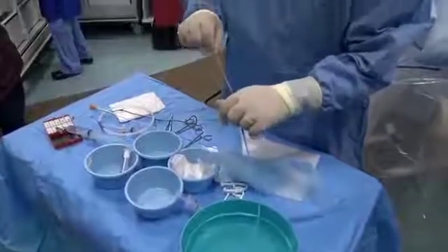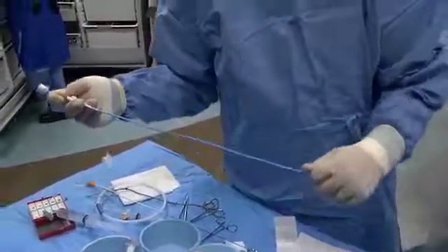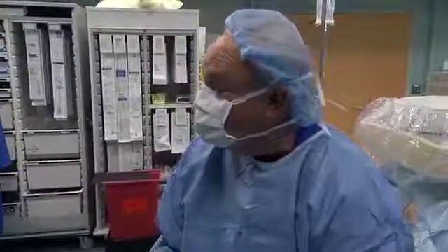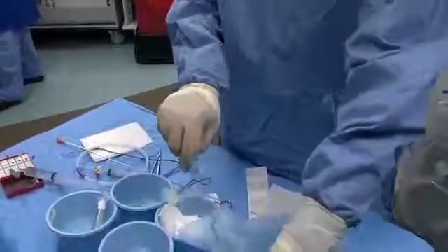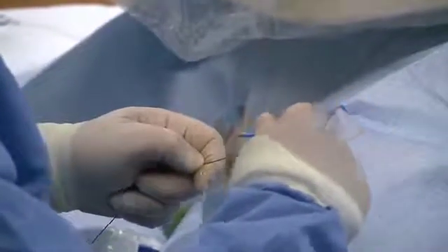Since we are doing a biliary catheter exchange, I prefer to use the Flexible Stiffening Cannula. For initial biliary catheter insertions, I start with the metallic stiffener until I get to the bend in the biliary duct, then exchange the metal stiffener for the plastic stiffening cannula. If I try to advance the catheter around the bend without any cannula, the catheter tends to buckle upon itself. Although this is a biliary catheter exchange, I am upsizing the catheter from 8 French to 10 French to promote additional drainage. As a result of the size increase, the patient will feel some temporary discomfort upon insertion of the catheter.